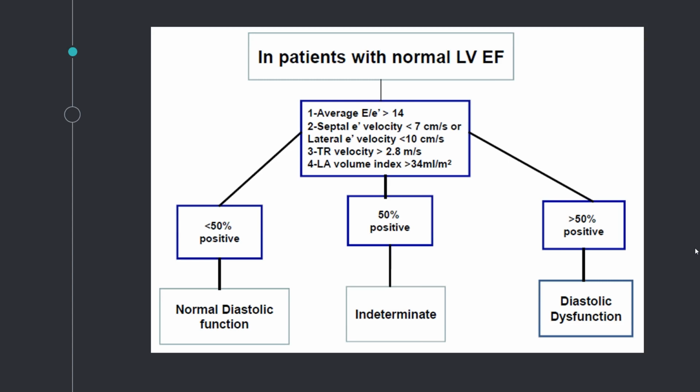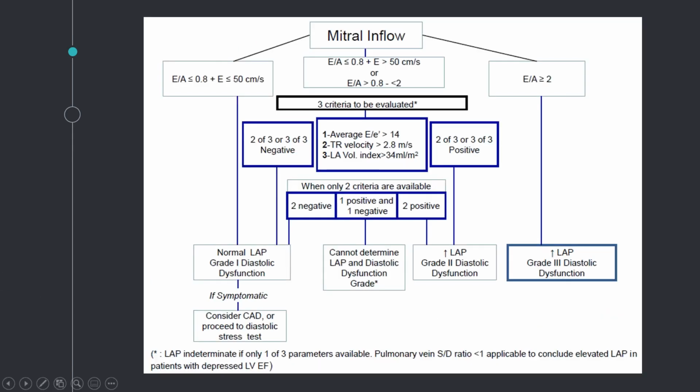It's very close. I think what some of our readers do is say that by guidelines it's indeterminate diastolic function, but high E over E prime suggests high filling pressures. Yeah, I guess that's a way to nuance it. But if you use the old guidelines, a lot of these indeterminate will end up grade 1. Yeah, I agree, and that's what we found in the SAPIEN cohort. But sorry, just to clarify, shouldn't all TAVI patients be in the second algorithm with myocardial disease? Yeah, but a lot of them, like a third of them, end up in the indeterminate. It's a lot. Well, that's one of the pitfalls of this particular guideline.